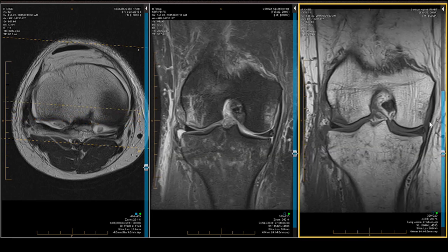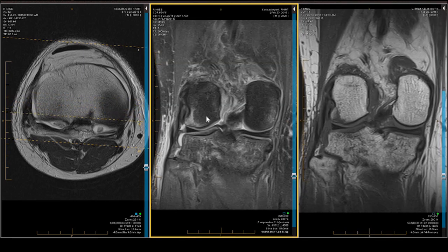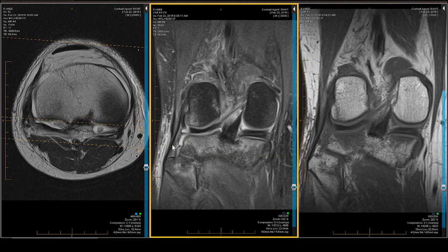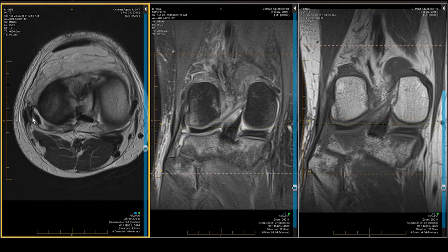If he had a straight valgus injury you'd see rupture of the MCL; if he had a straight varus injury you'd see rupture of the LCL or fibular collateral ligament. We're able to identify that structure in both the coronal and sagittal projections. Right here is the fibular collateral ligament, that's the popliteus, that's the FCL, and the next layer out is the long and short head of the biceps femoris.